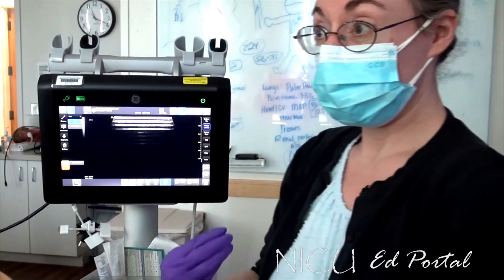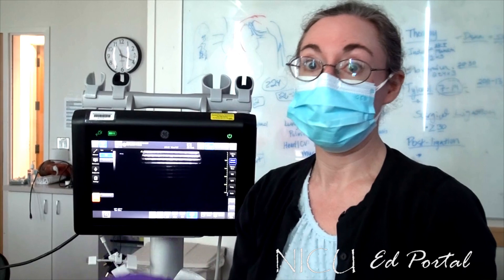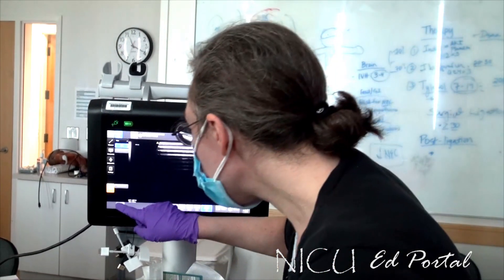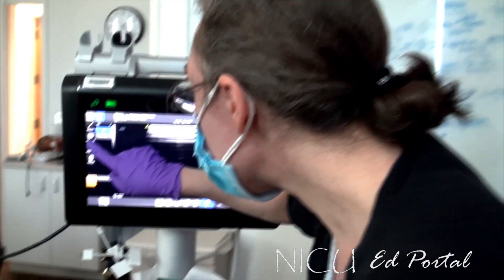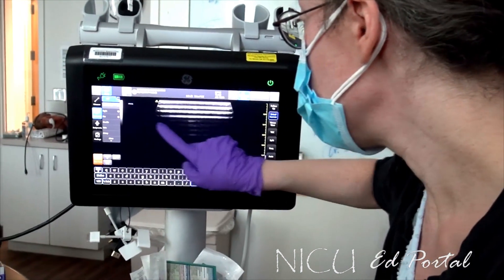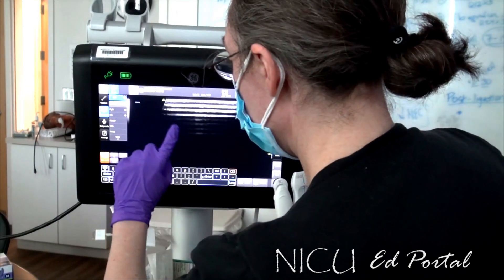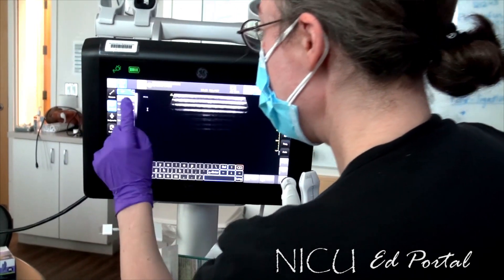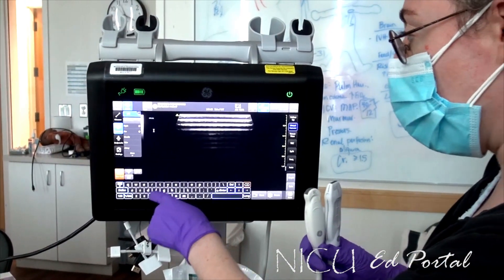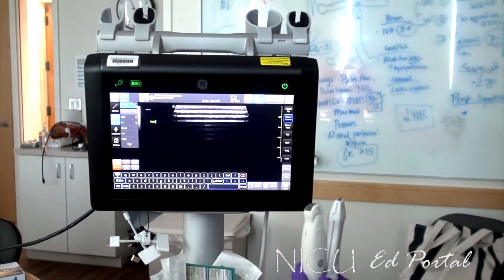My personal philosophy is I do not like to see text on the image because I don't want it to interfere with something I might need to see. So we usually put the text up here in the top left corner. You can put in text comments and then move it up to where you want it. You get these choices so you don't even have to type — if you just want to click 'vein,' it'll just auto-populate, which saves some typing.